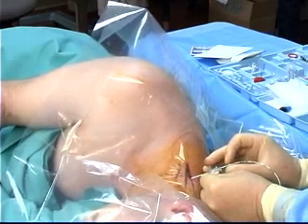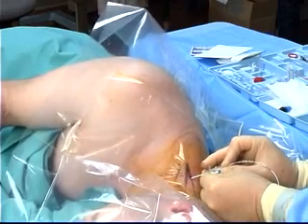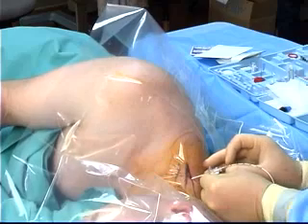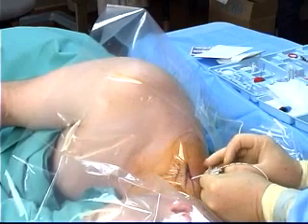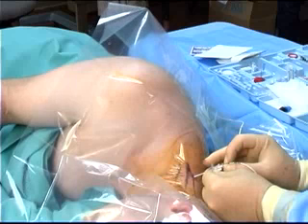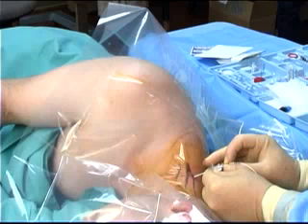Advance the catheter beyond the needle tip. If the motor response disappears, carefully withdraw the catheter tip to inside the needle shaft. Make a small adjustment to the needle by rotating it clockwise or counterclockwise, or advancing it slightly or withdrawing it slightly. Repeat this maneuver until the muscle twitches remain unchanged during catheter advancement. This indicates that the catheter tip is now situated on the nerve root.